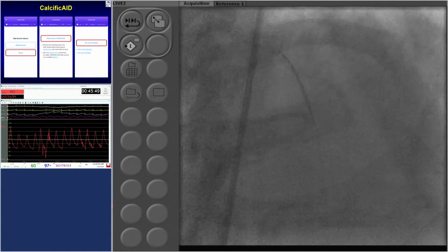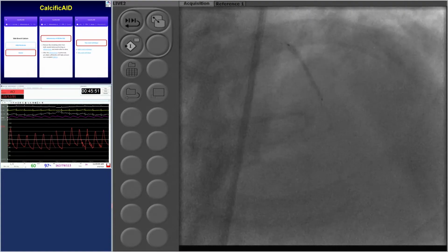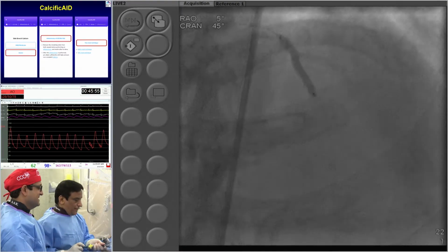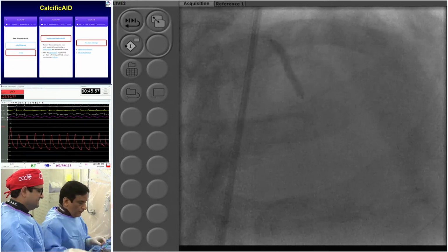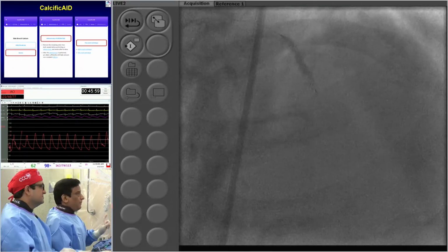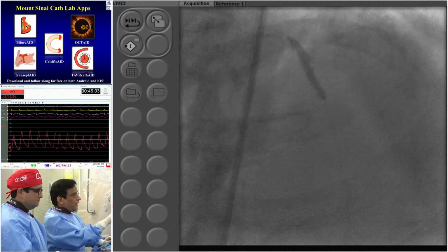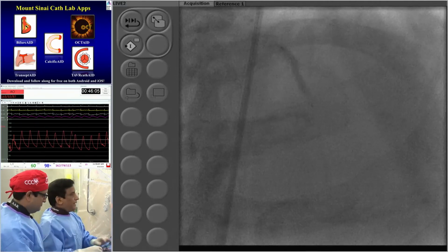That's why they have to refer these cases to you, Dr. Sharma. Well, that is why our growth is good, and we now have 22% atherectomy done in the Mount Sinai cath lab. So we are going to show the picture here. We have put 2 stents, and they will be ready in room 1. If it looks good, we are going to recross and kiss.